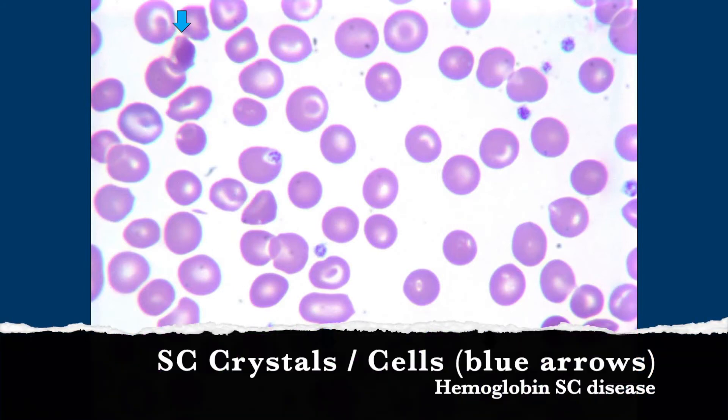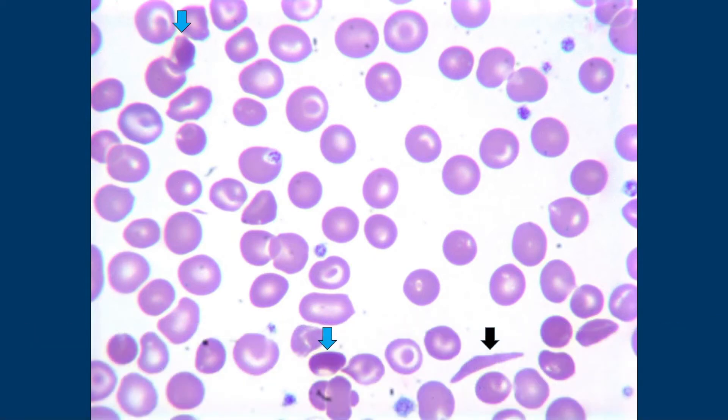So those are either called SC crystals or SC cells. This patient has hemoglobin SC disease instead of hemoglobin SS sickle disease. It's a combination of hemoglobin C and hemoglobin S together, and hemoglobin SC makes these irregular crystals.